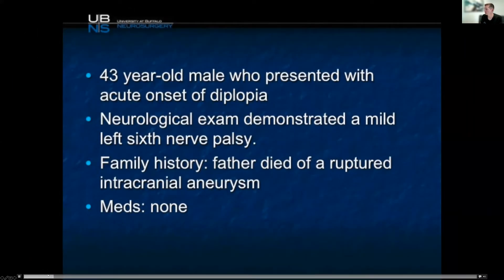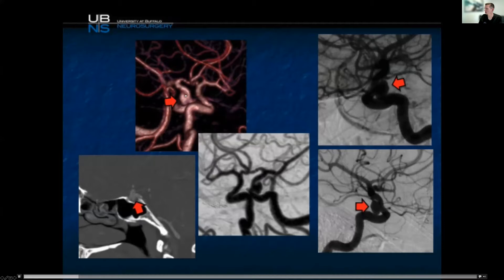43-year-old male, presents with diplopia, left sixth nerve palsy. Father had a ruptured aneurysm. This is one that needs to be treated — it's a symptomatic aneurysm. You can see here a pretty large cavernous ICA.